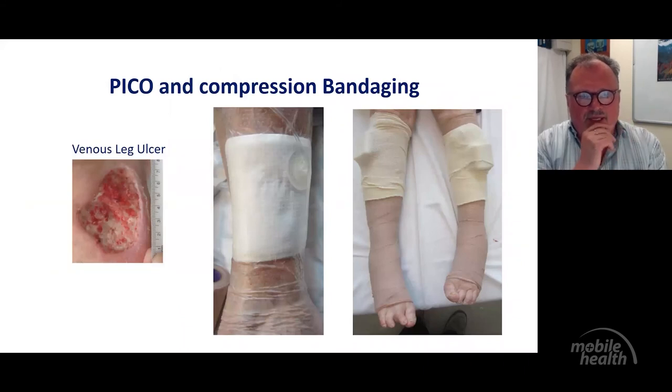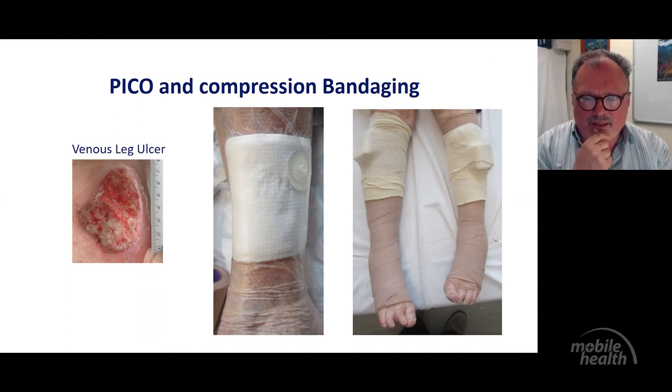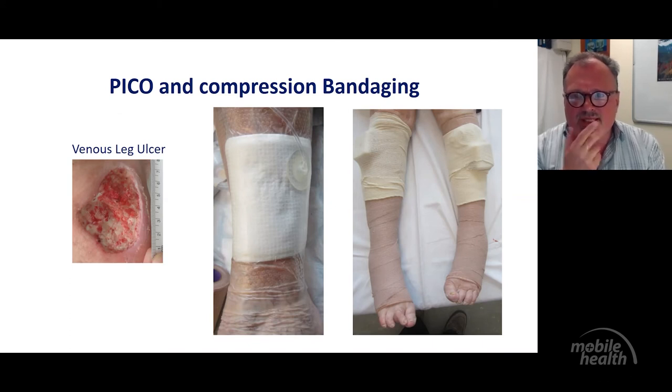We do use canister-free negative pressure for other wounds. For example, here's a leg ulcer wound, which is suitable for this type of application. It is a very nice small device. We can apply it on the lower limb, and also apply it with compression bandaging, like on this lady here who was in her mid-80s, where we applied compression bandaging on both of her lower leg wounds after ultrasound debridement, and she coped very well with this. As you can see, there is no bulky machine attached to it.